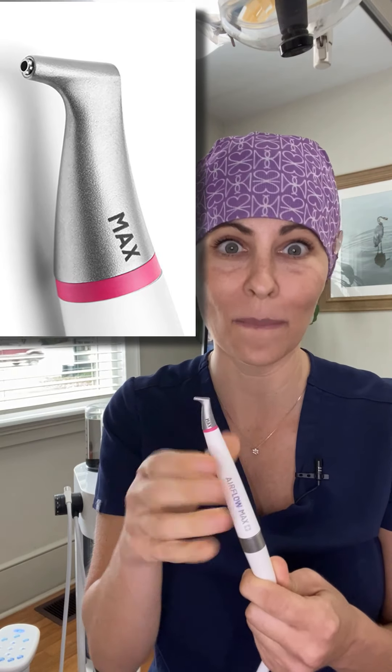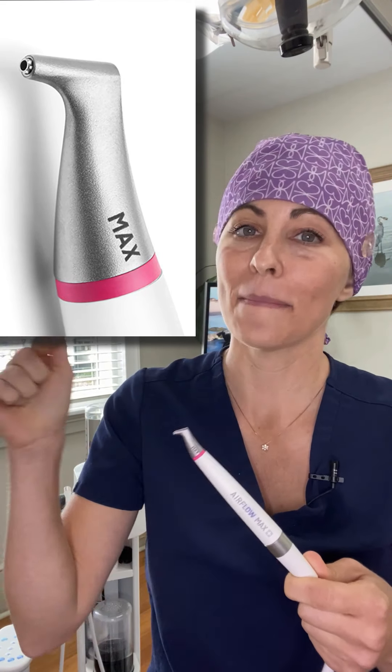The max safety comes from a unique hexagon design that reduces aerosol splatter by 60 percent. The max efficiency is because of a precisely staged acceleration powder channel that produces maximum efficiency. And the maximum comfort comes from the optimal synergy of air, powder, and water that reduces handpiece noise and makes airflow more gentle for the patient.